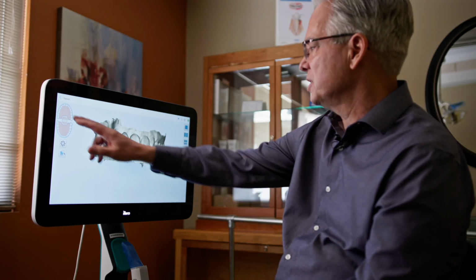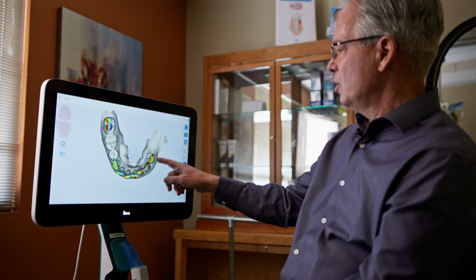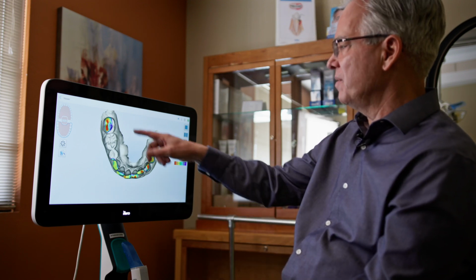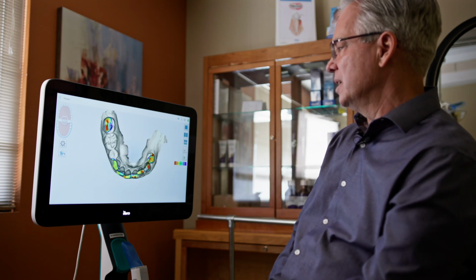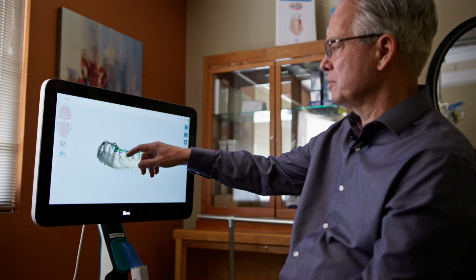I want to know what their bite's doing, so I can ask the computer, okay, where are the teeth touching each other, and why are they wearing down? So now with this color-coded scheme, it's telling me where the teeth are hitting and how intensely they're hitting. For example, red is where they're hitting the heaviest, and these other areas are where they're not hitting. So it really starts giving me a lot of insight into what's happening in the mouth, and it's a very accurate technology to be able to do that.